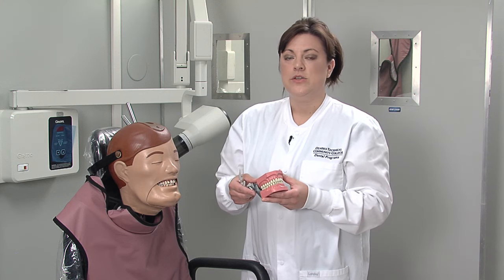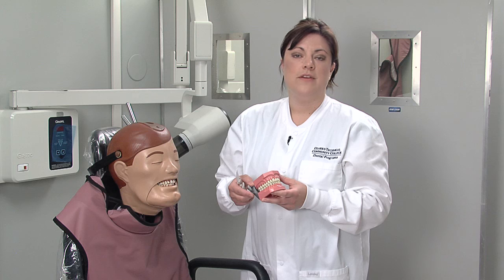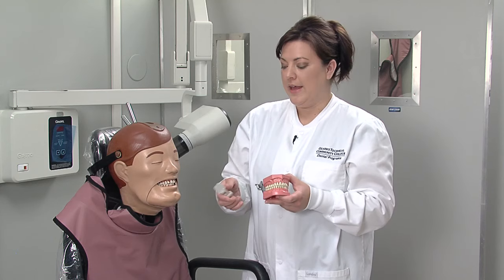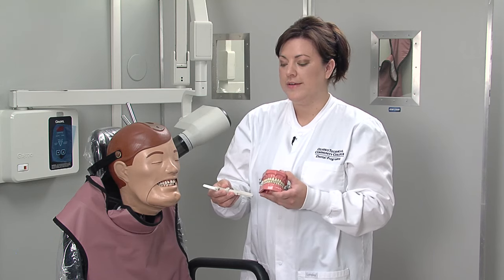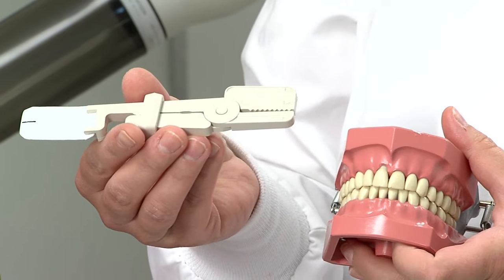Patients who have a shallow palate, crowded teeth, or a very small arch will require some alteration to your technique. Your next choice is the bisecting, and the film holder of choice is the snap array for the bisecting technique.